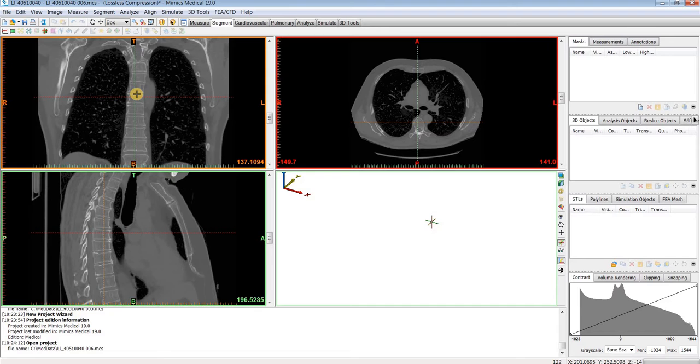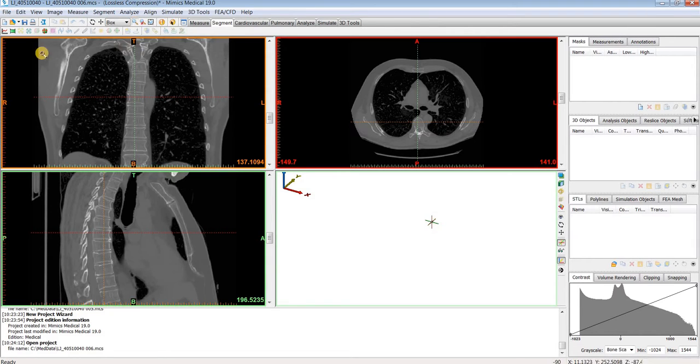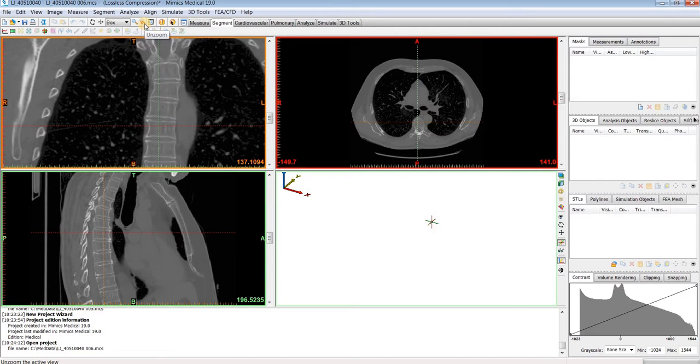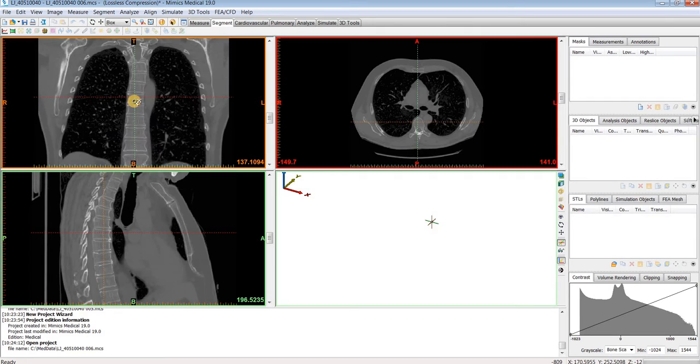If you'd like to zoom in and out of the images, you can click on this magnifying glass up here and then drag a rectangle around any region you want to zoom into. To zoom back out, click the magnifying glass with the red X and then back on your plane, left click and it will zoom back out.